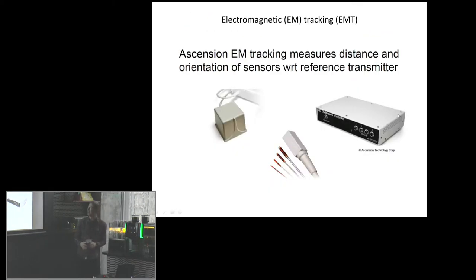Okay. So, another sensor, electromagnetic tracking. Anyone familiar with that? Do you know what it's normally used for? It's typically used in minimally invasive surgery, where you want to track your instruments inside the body, where the position is. That's the most common use as far as I know. You have this transducer that generates an electromagnetic field in a room, and these are the catheters. So it has a coil, so you can then know the position relative to the transducer in space. That's the key. So we want to test this in hearts.